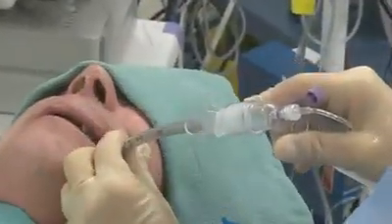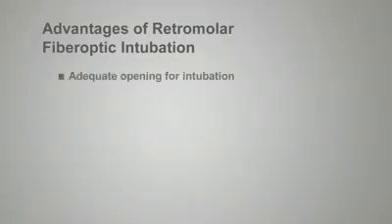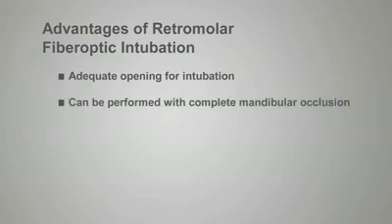The retromolar approach for flexible fiberoptic intubation has many advantages. It provides an adequate opening for intubation when mouth opening is restricted. It can be performed even in cases of complete mandibular occlusion.